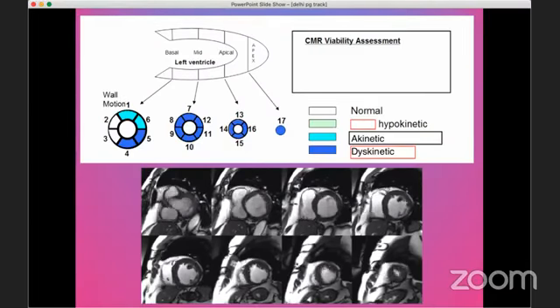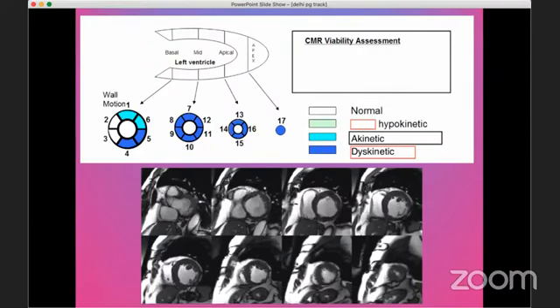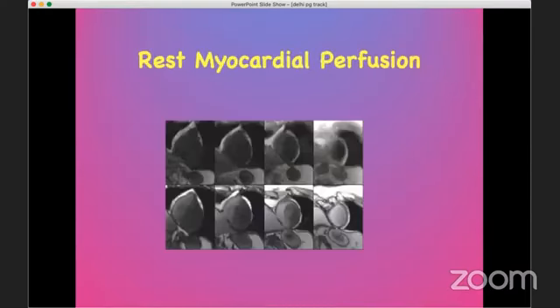You will know that the American Society of Echo and the Society of Cardiac MRI work together in more than one instance, and many of the times they publish joint statements. So we start with the basal, mid, distal, and finally the apex, which is here. So the same American Society guidelines apply here in MR, and that's what you're going to see.